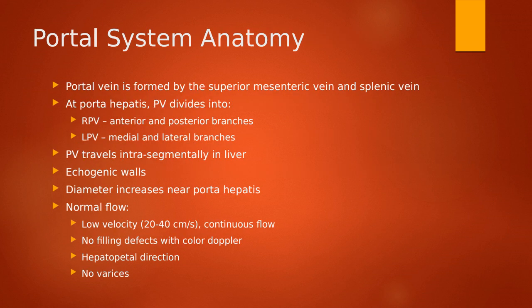Moving into our liver here, again, very straightforward. This should all be reviewed. You should be performing a lot of these exams in clinic at this point, so you can go over this on your own here. We know that we should be seeing normal flow, and we should be aware of what normal flow looks like in our portal system with the liver.